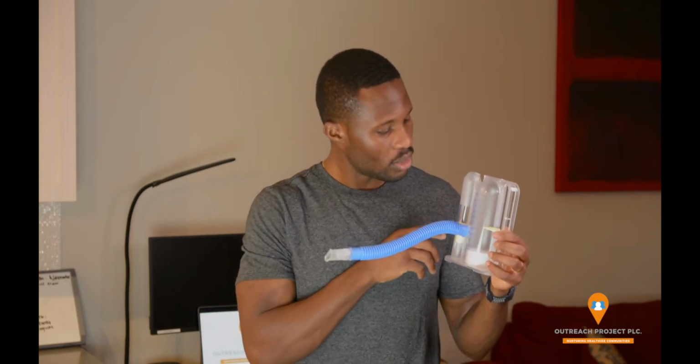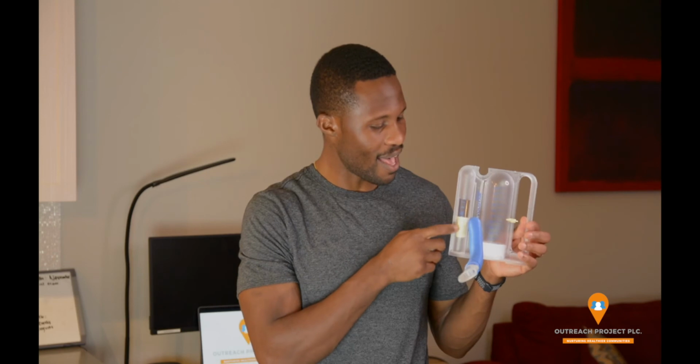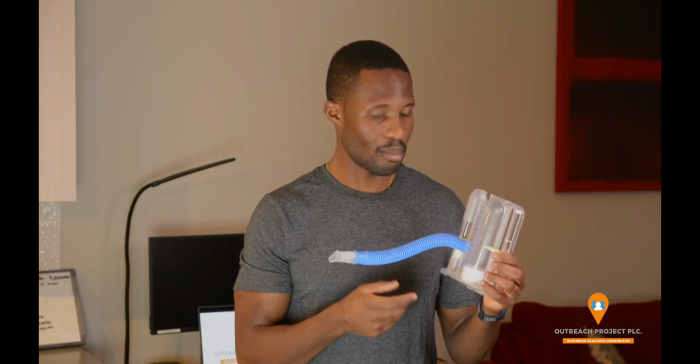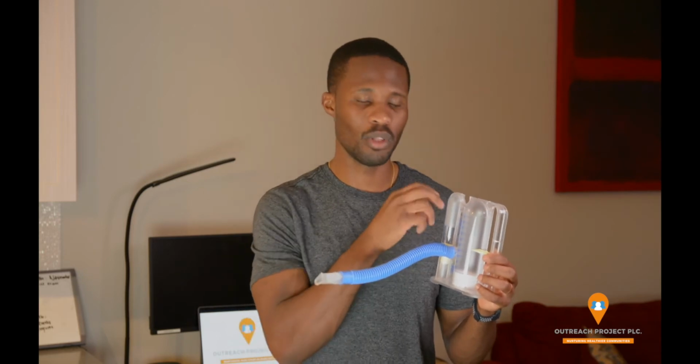inhaling. Some of them might also have another portion here, and this portion is to show how well you are performing, how's your performance. But you don't look at one of these on its own, you look at them both at the same time. And we'll talk about the target that we want for both of these.